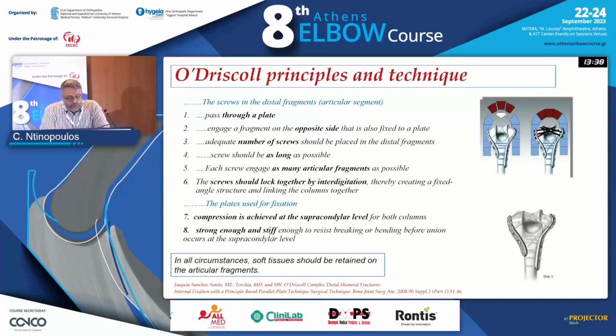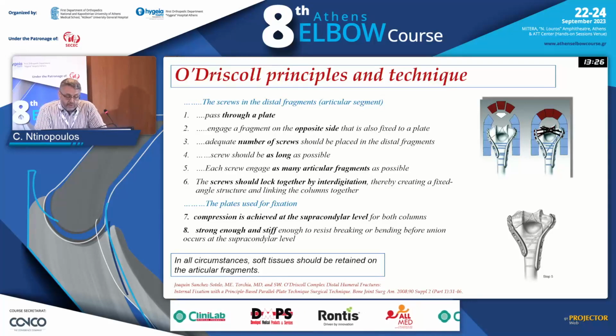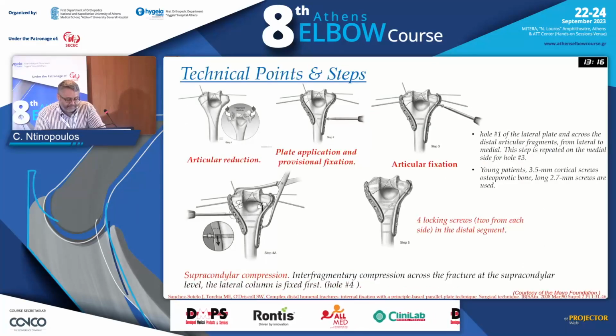Plates should be compressed on the supracondylar level for both columns, both sides, and be strong and stiff enough to resist the early rehabilitation of the patient. In all circumstances, we should be aware that we shouldn't apply soft tissue stripping on the articular fragments.